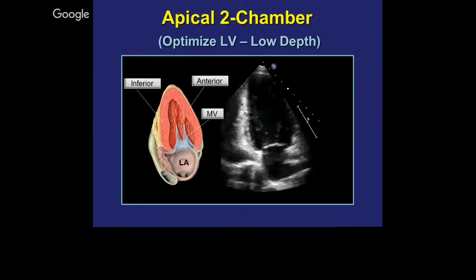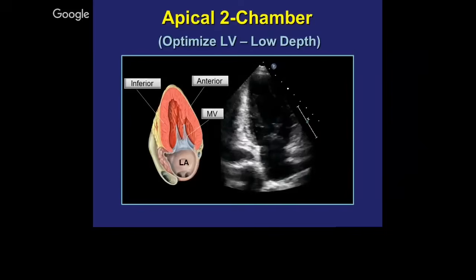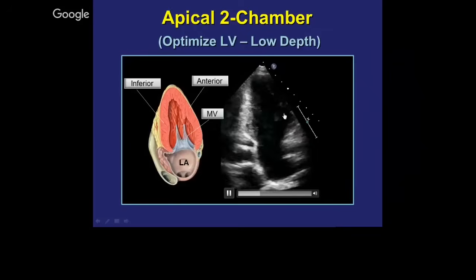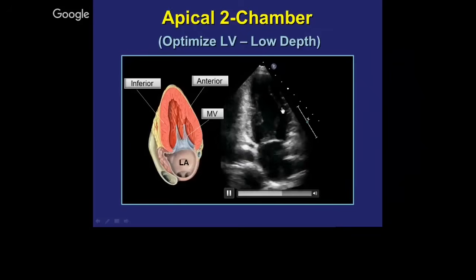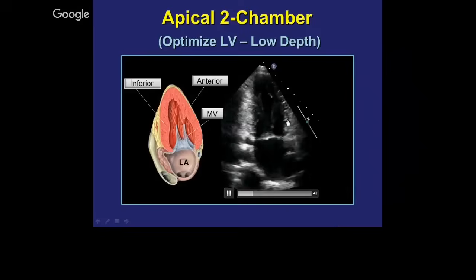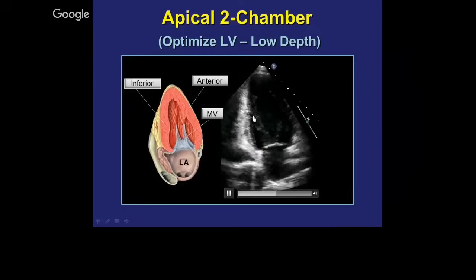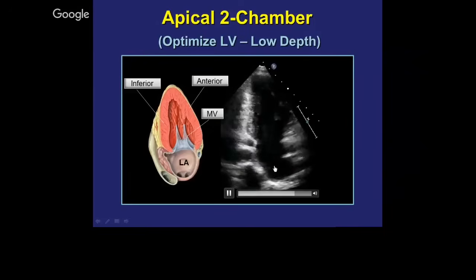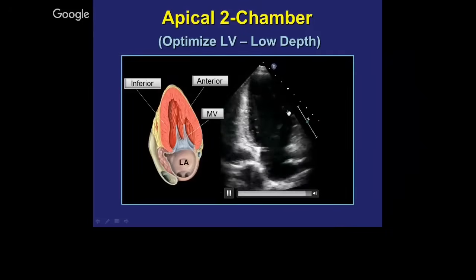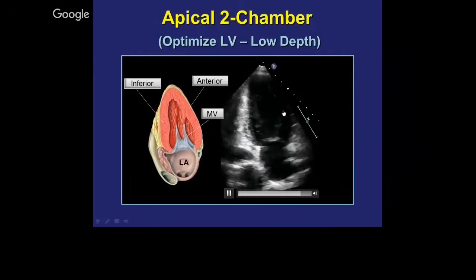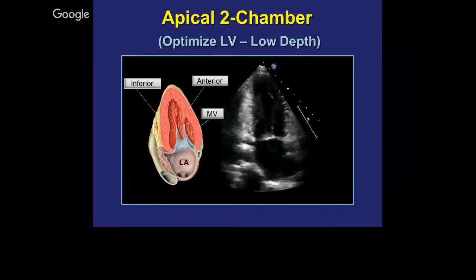Here is what we call the two-chamber view. The advantage of this view is it looks at the pure anterior wall — unlike other views that look at the anterolateral wall, this is the true anterior wall and the true inferior wall. You only look at those two walls and you see the mitral valve and the left atrium. It's a good view when looking for regional wall motion abnormalities to rule out anterior or inferior myocardial infarction.